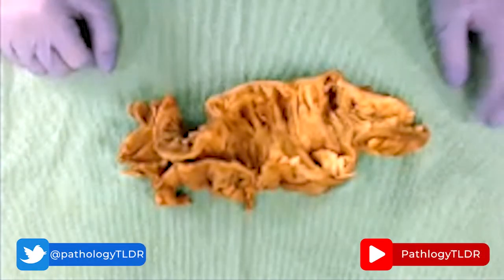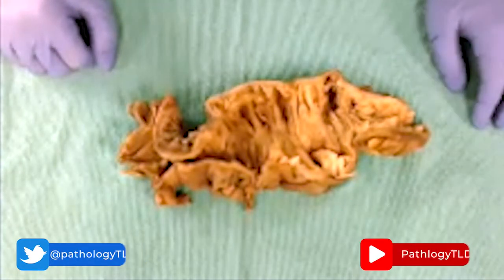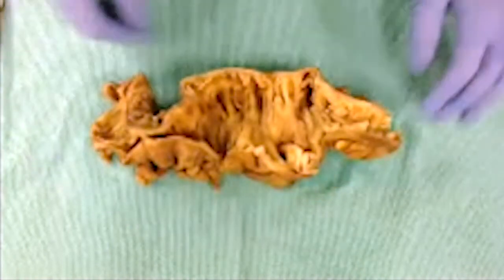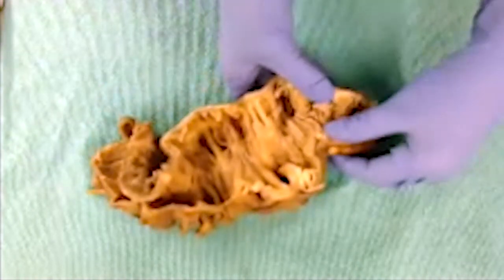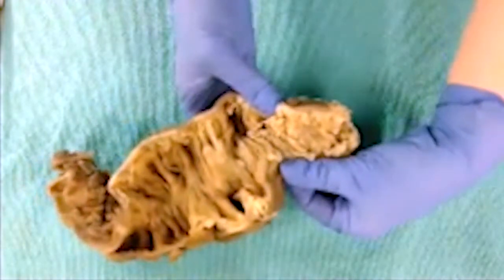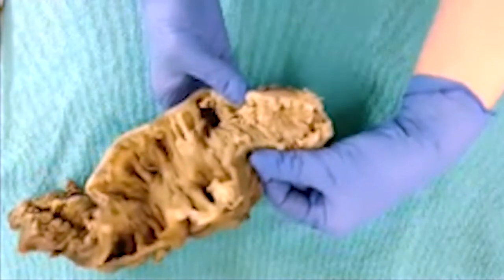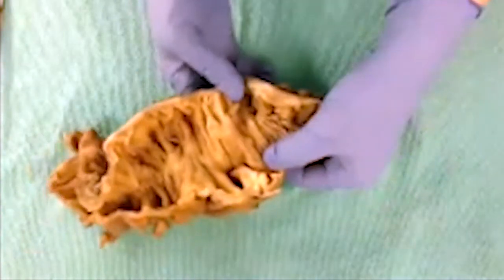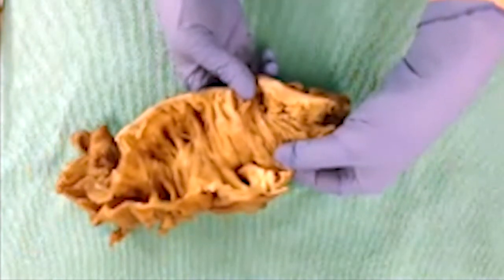The caliber of the large versus small bowel is also different, with the large bowel being larger, but we don't have anything to compare it to in this case. Also, there's differences in the appearance of the mucosa in the small and large bowel. So in the large bowel, we do see non-circumferential folding, as well as a more smooth mucosa rather than the granular appearance in the small bowel.